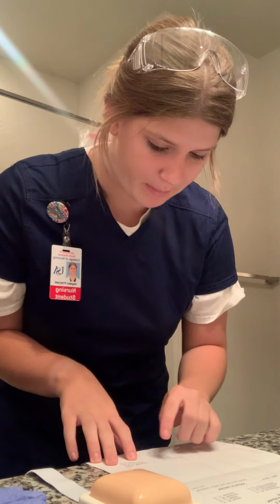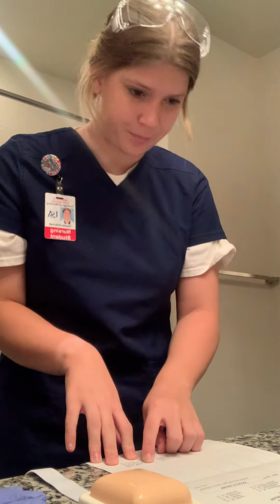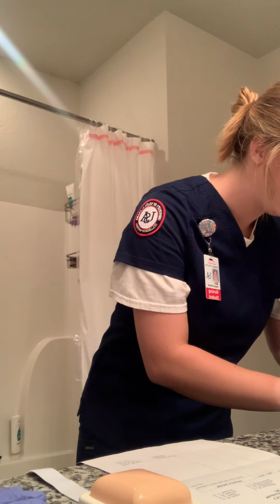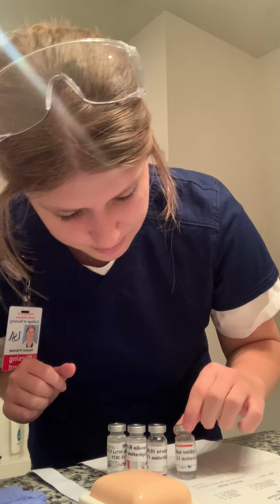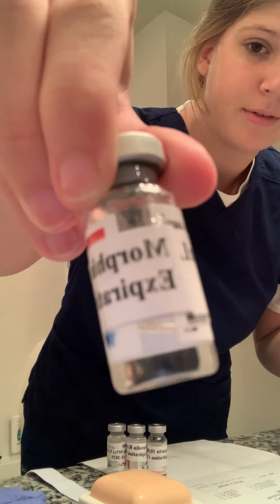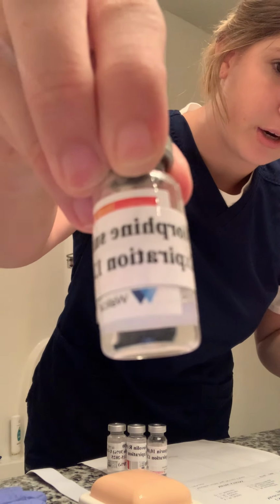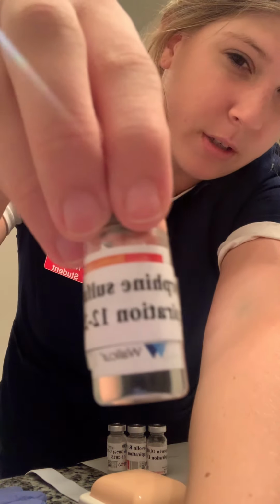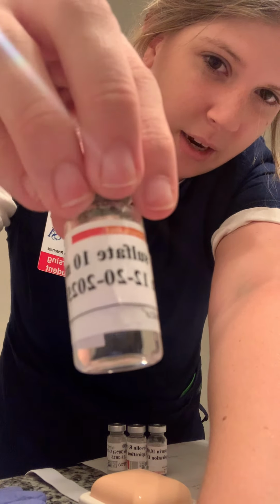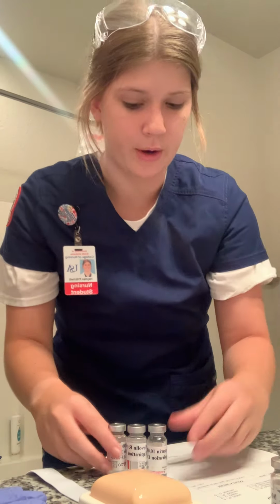So I'm going to make sure my patient is correct, Jaguar J. Jones. And the first thing I'm going to look for is the morphine sulfate. I have my vials here, and I'm going to pick my morphine sulfate, which expires 12/20/2025, so it is good to use. There it is. Okay, so now I've selected that.